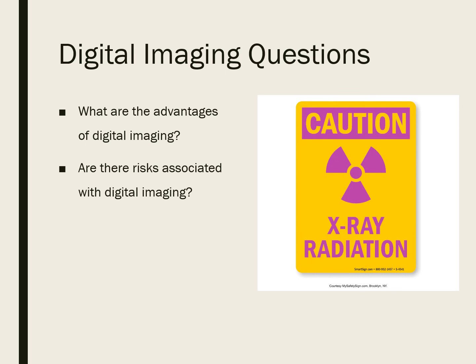The risks are the same as the risks were for traditional film. There is a small amount of risk that is associated with having X radiation done in the dental office. However, radiation exposure is actually reduced by anywhere between 50 to 90% through digital imaging over traditional film imaging. And what's also really nice is that through digital imaging, we are saving the planet from those processing chemicals as well.